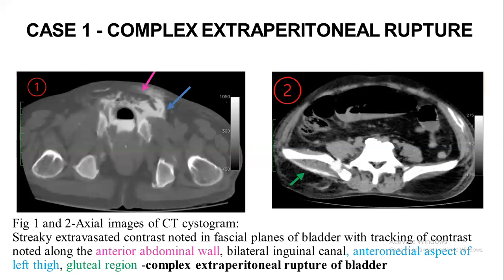Case 1 is a complex extraperitoneal rupture. Images 1 and 2 are axial images of CT cystograms showing extravasated contrast noted in fascial planes of the bladder, with tracking of contrast noted along the anterior abdominal wall, bilateral inguinal canal, and anteromedial aspect of left thigh and gluteal region, indicating complex extraperitoneal rupture of the bladder.